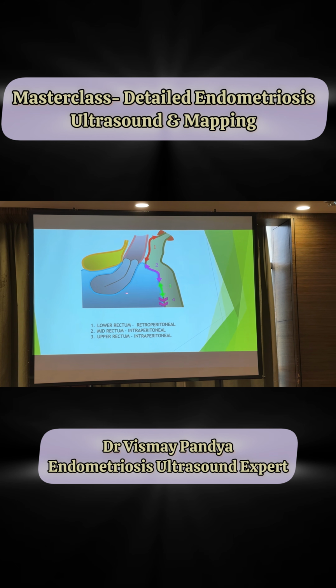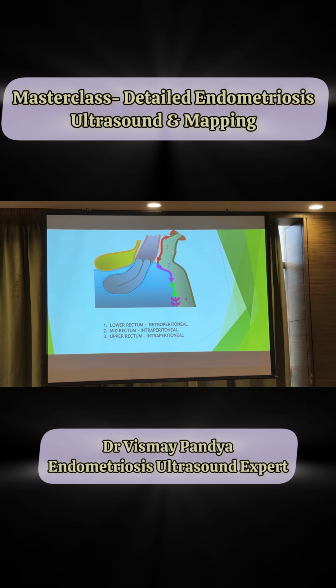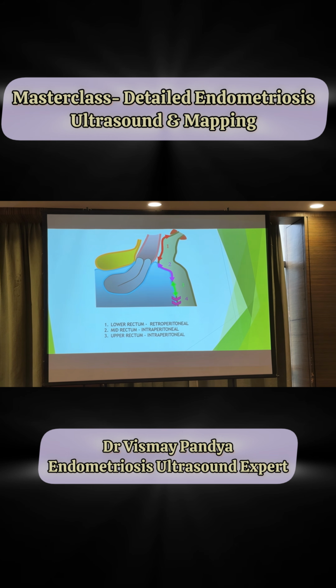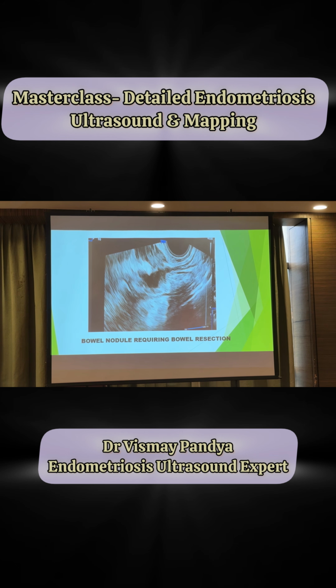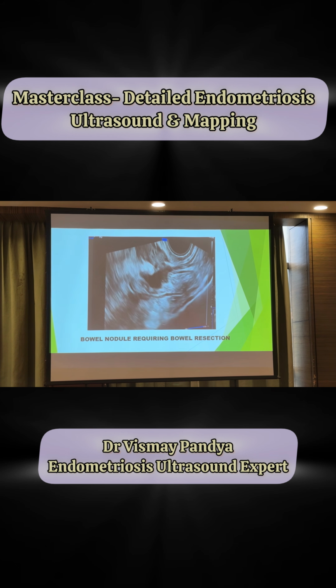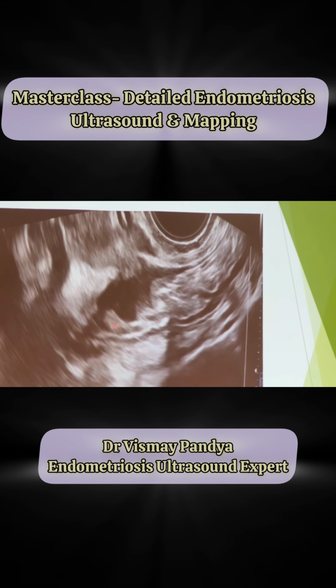So if you see a nodule at the fundus, it may be upper rectal. At the back of the uterus, at the torus, it will be mostly mid-rectal. So this gives an idea about the resection margins and the prognosis. Okay. So you can see, this is the bowel nodule.